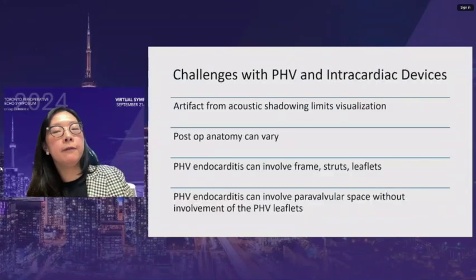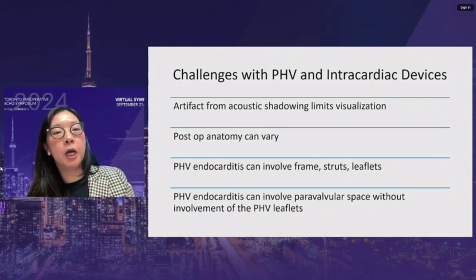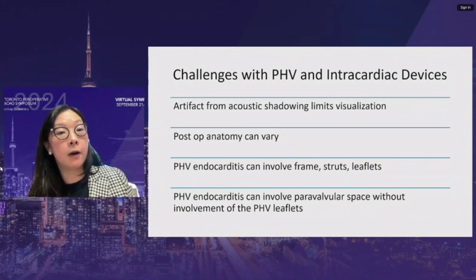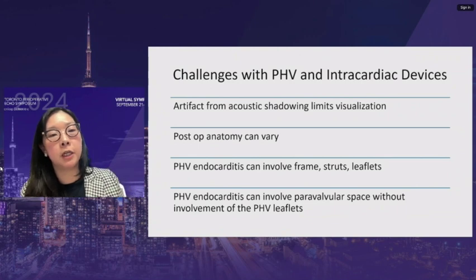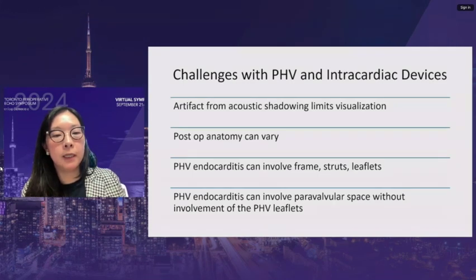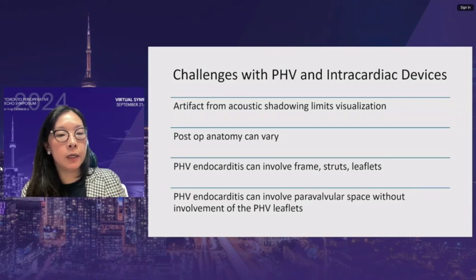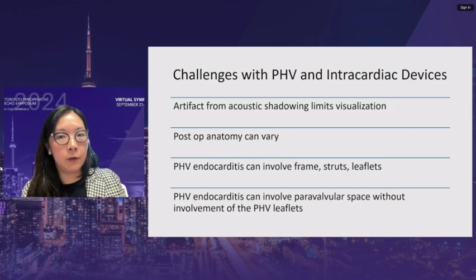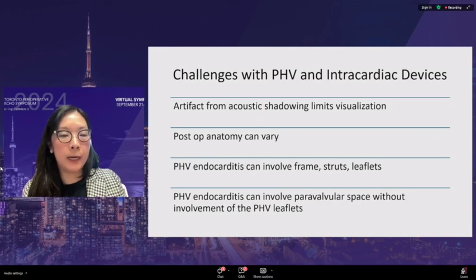Prosthetic heart valves and intracardiac devices are challenging to image with TEE due to acoustic shadowing that limits visualization. Post-operative anatomy can vary, and prosthetic valves and intracardiac devices can involve the frame, struts, and leaflets. Importantly, the paravalvular space can be involved without leaflet involvement — there may be abscess formation with a perfectly functioning valve.